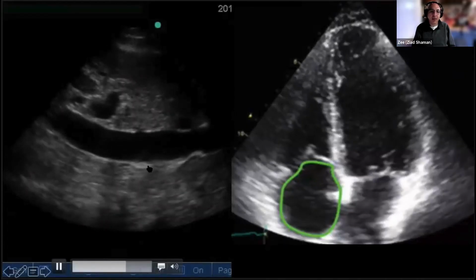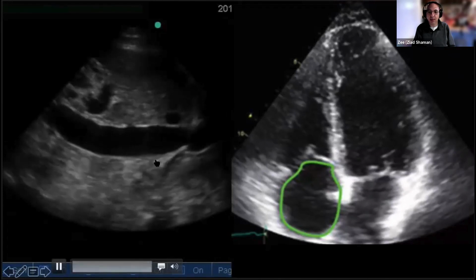You look at the inferior vena cava, you see that it does not collapse at all, and it's really big. It's about 2.5 centimeters. However, I lost the presentation, but the patient in the meanwhile had gotten intubated, and is on positive pressure ventilation. So can you use the inferior vena cava as a point to add to say that the person has higher risk of pulmonary hypertension?